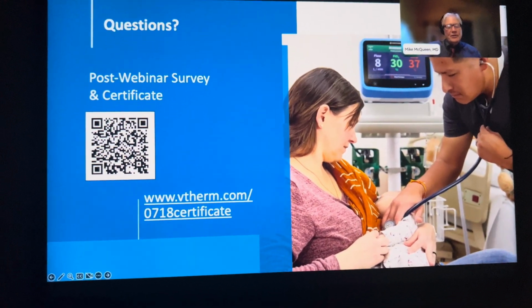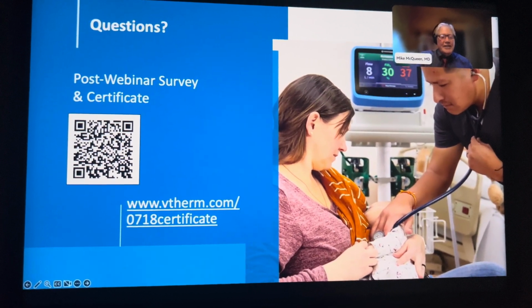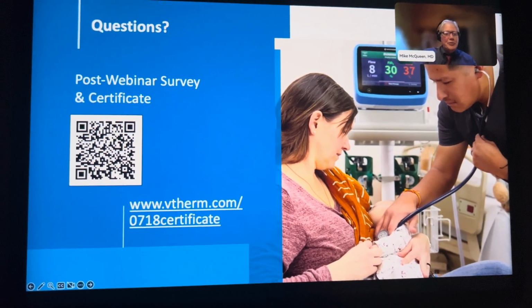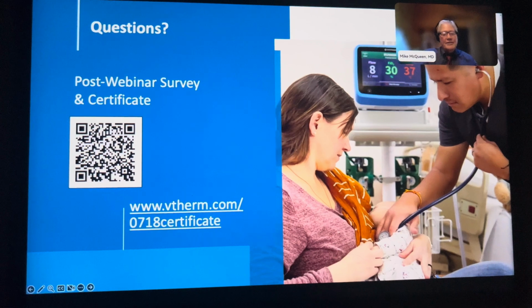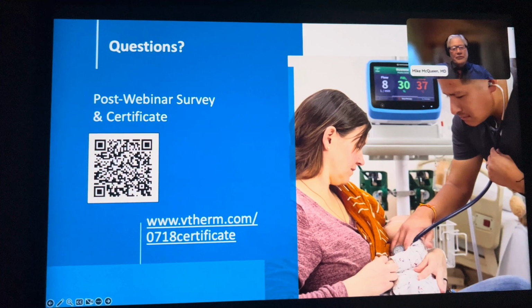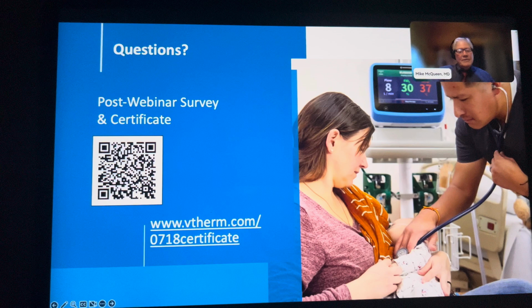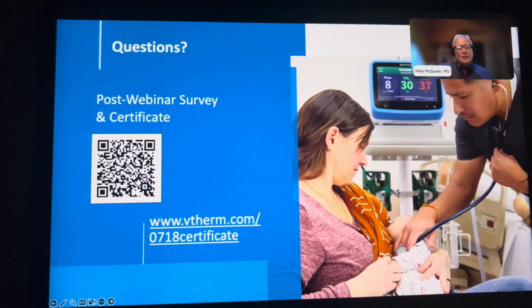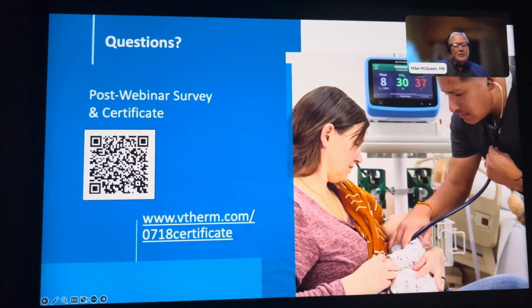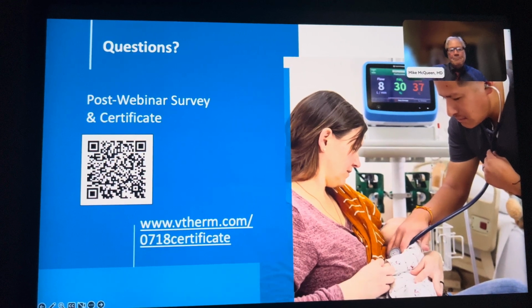The more aggressive users tend to start at the high end of that, the 2 liters per kilo. So if you have a 10 kilogram patient in your PICU or presenting at your ED, start at 20 liters per minute. Use the non-occlusive interface. You're not going to deliver any inadvertent pressure. It's just as comfortable for the kids with the warmth and humidification and the non-occlusive interface as it is for the adults. You watch the dyspnea resolve. Once you capture their work of breathing, so to speak, then you can titrate down the flow. So again, 1.5 to 2 liters per kilo per minute, and don't be afraid to use it on the kids. The mechanism and efficacy are the same.